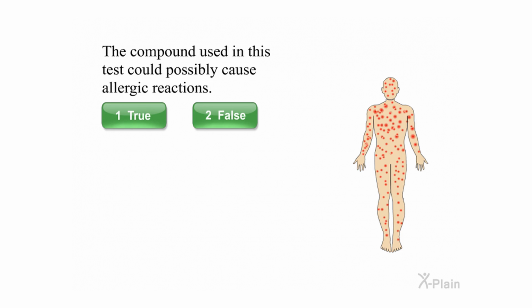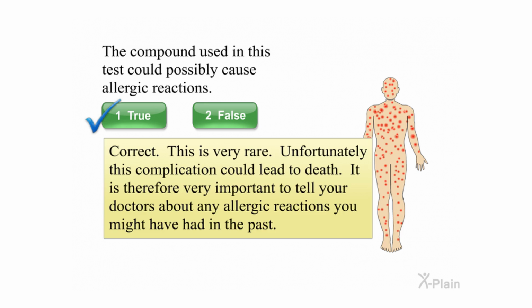The compound used in this test could possibly cause allergic reactions. Select true or false. Correct. This is very rare. Unfortunately, this complication could lead to death. It is therefore very important to tell your doctors about any allergic reactions you might have had in the past.